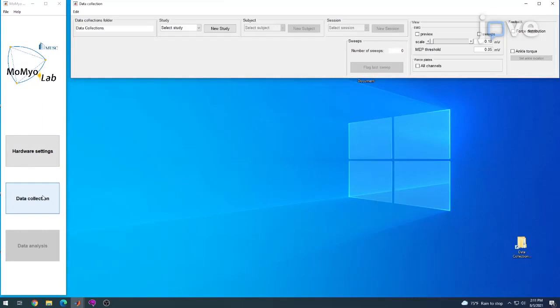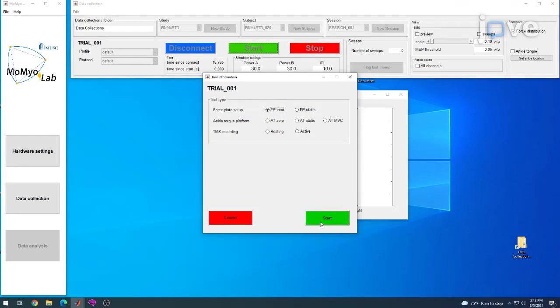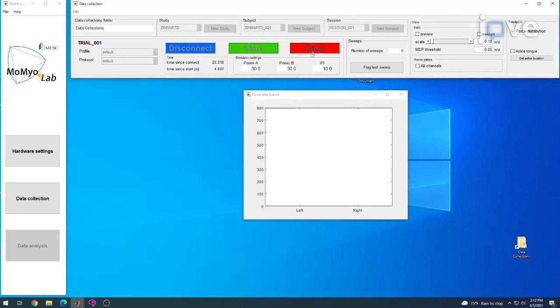Open the data collection software and start a new trial to calibrate the dual-top force plate. Click Start and begin an FP0 trial. Collect 3 to 5 seconds of data with no load on the force plate and then click Stop.